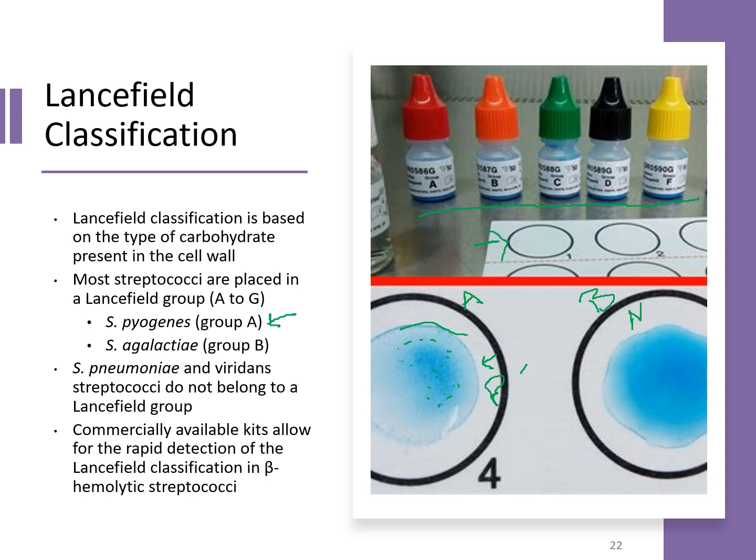And what you're looking for is, once you look at your hemolytic pattern and you're trying to decide for sure if it is one of these particular organisms, then you would test it against this reagent to help narrow down what organism you're working with.